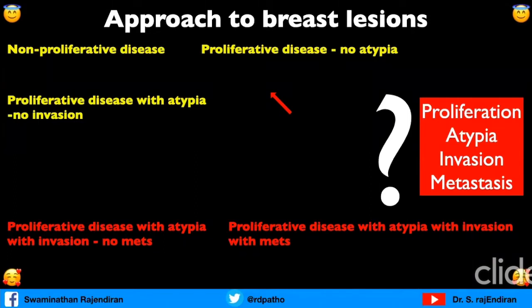Pathologically, practically, to diagnose, you have to classify them into 5 of these types. And within a type, for example non-proliferative disease, you can make a mistake. You can call ductectasia acute mastitis, and nothing will happen. Whereas you cannot cross the boundary. You cannot call it proliferative disease with no atypia. And I will show you some examples.